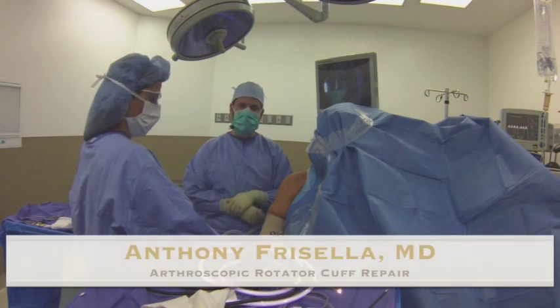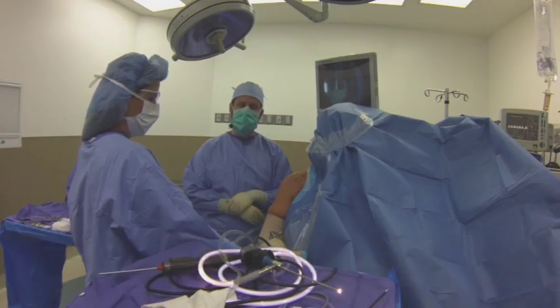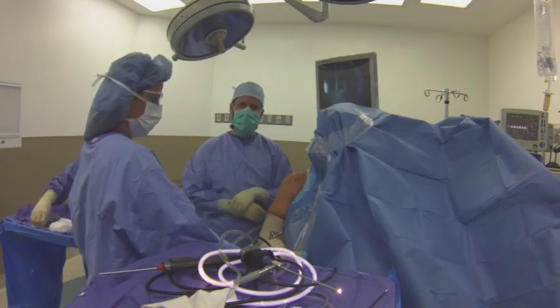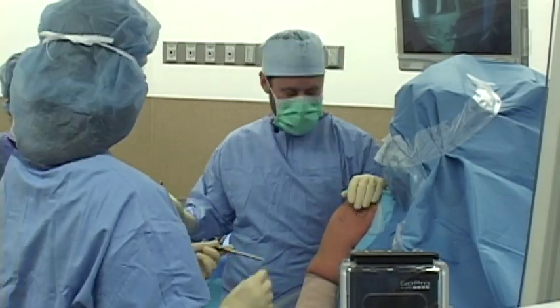I'm Dr. Anthony Frisella. Today we're going to show you a rotator cuff repair. The patient is a 56-year-old woman who I first saw two years ago with shoulder pain. At that time we sent her to physical therapy and she did well. She came back two years later and we sent her for an MRI. The MRI showed that she had a rotator cuff tear, and today we're going to perform a rotator cuff repair.